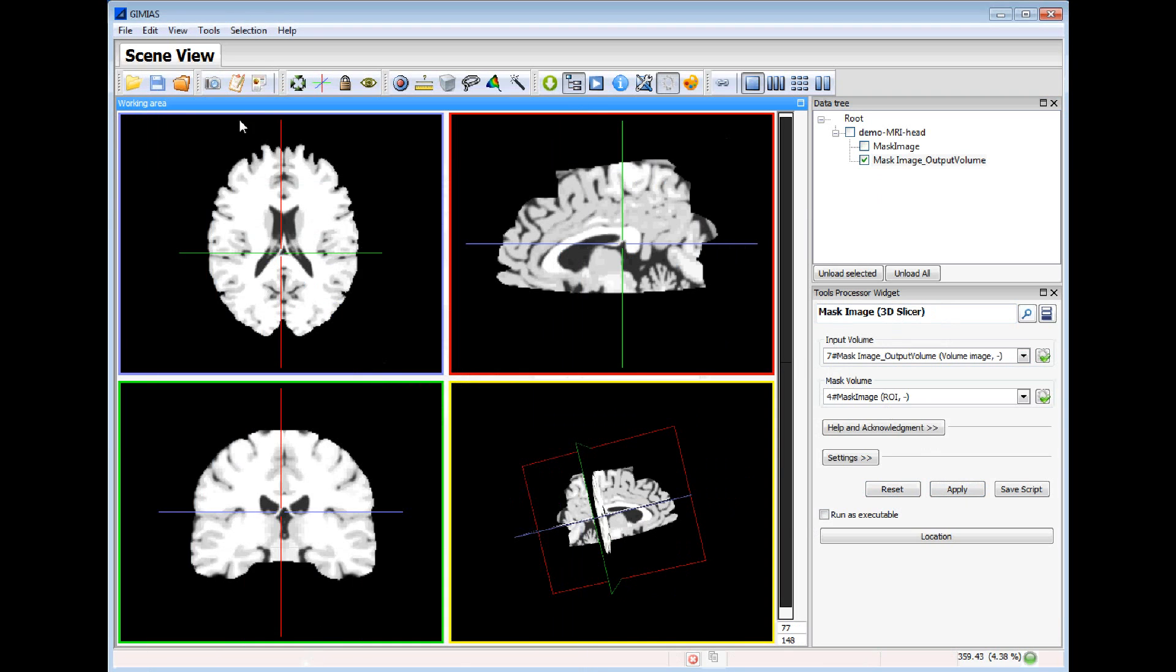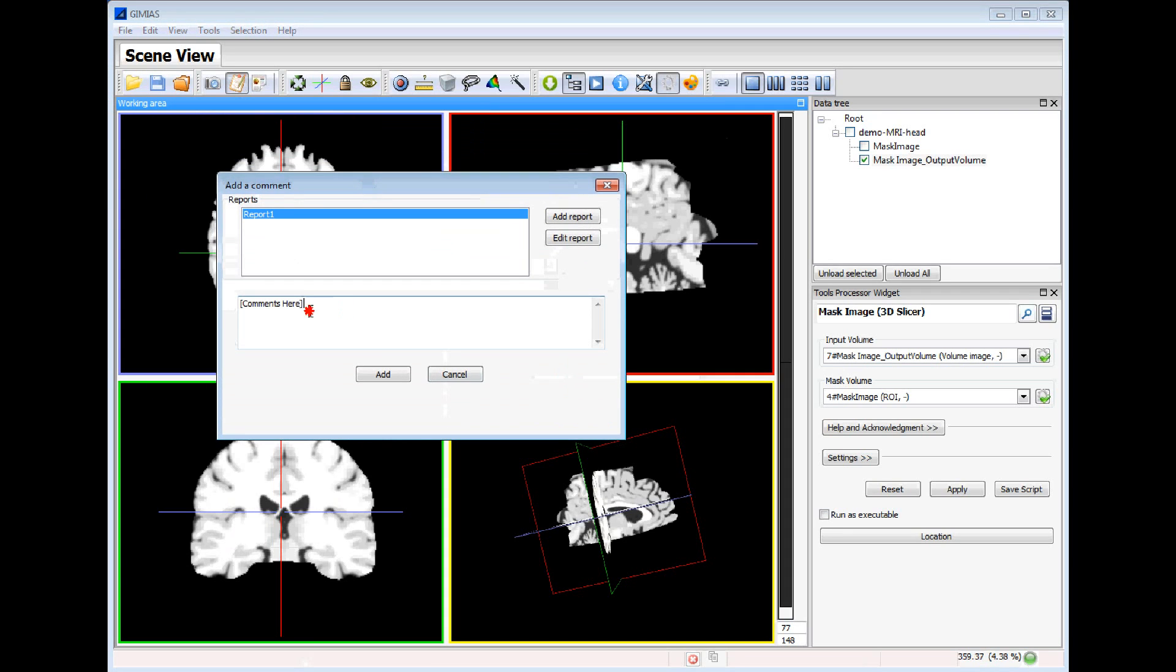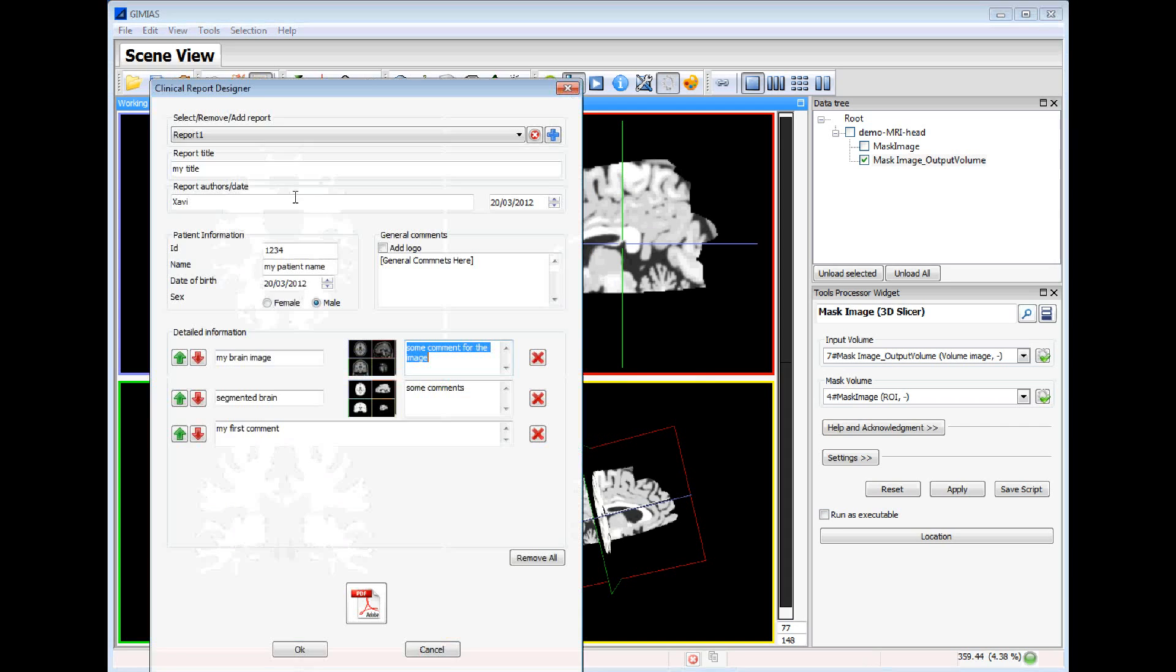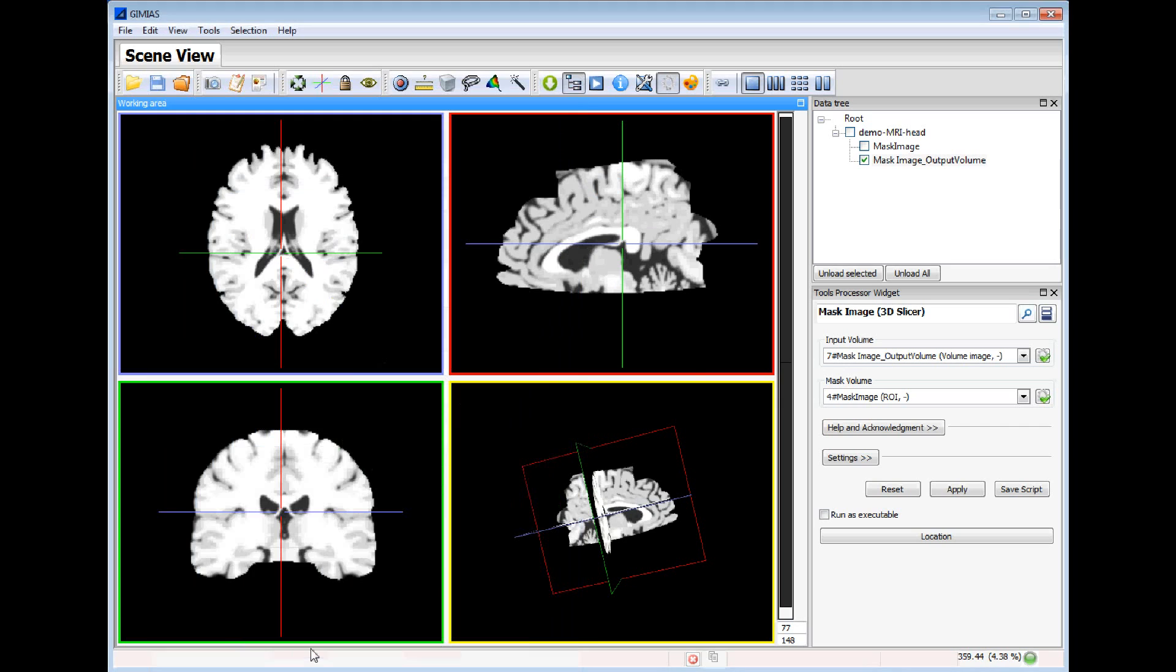We will add to the clinical report a new comment. And we will go to the clinical report designer. We can order the comment up and we can also change.